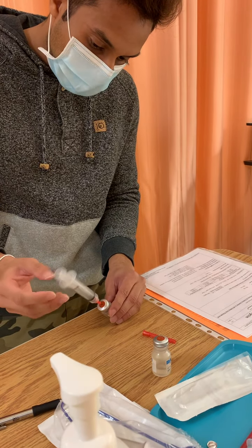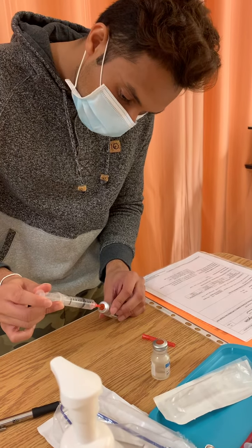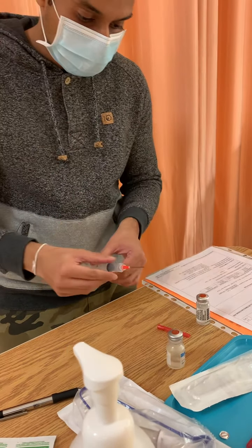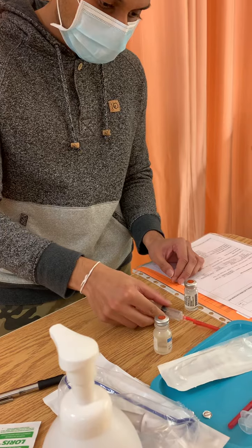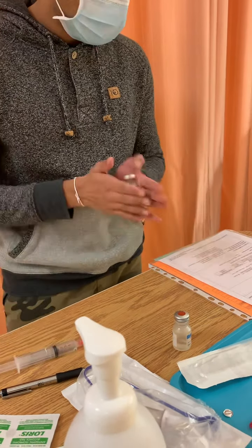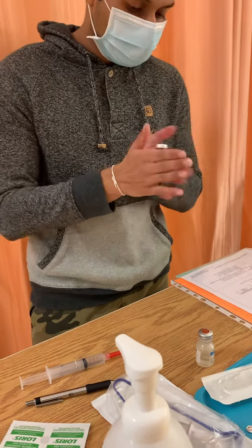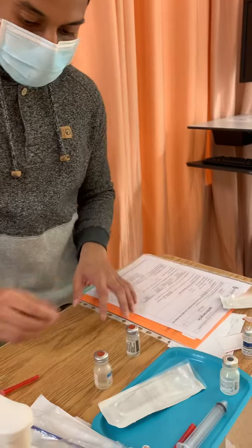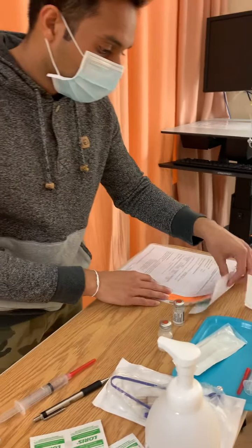We're gonna draw the medication out. Or draw the air out, sorry. We're using our scoop technique. Okay, we're just gonna mix this medication so it gets reconstituted. And you see there's no sediments, no air bubbles in there, so it's good. It's mixed well. And we're just gonna go over calculations before we draw the medication out.